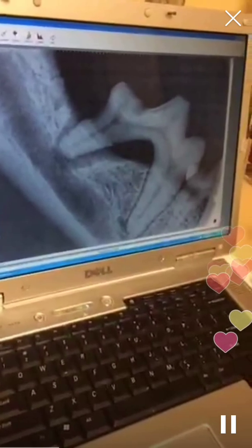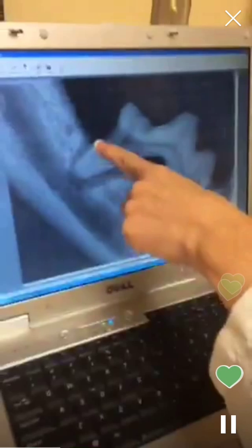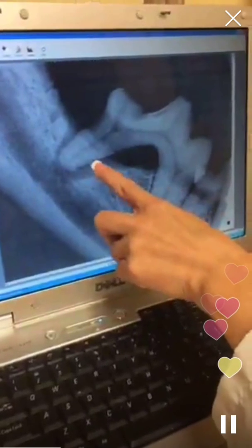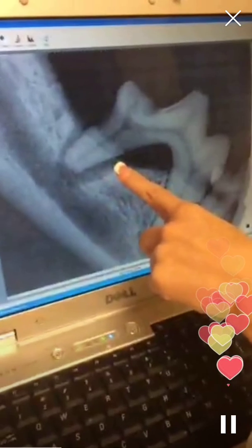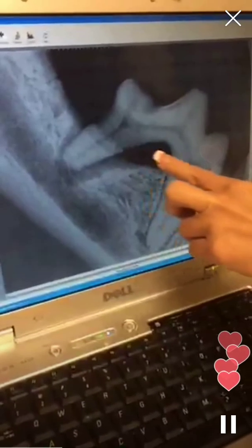And where are we? We are here. This big tooth in the back. This root is very infected. So this is widening of the periodontal space and a periapical abscess. And the bone should actually come all the way up to here. So we have furcation, meaning you can have a space in between that tooth.